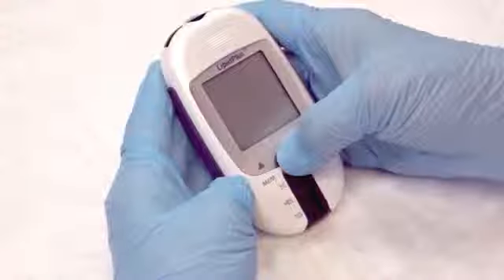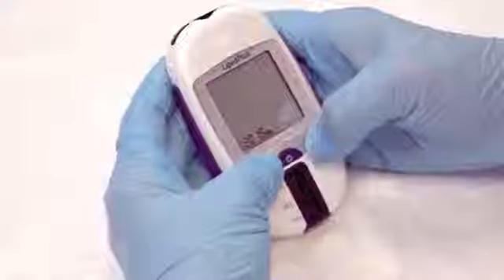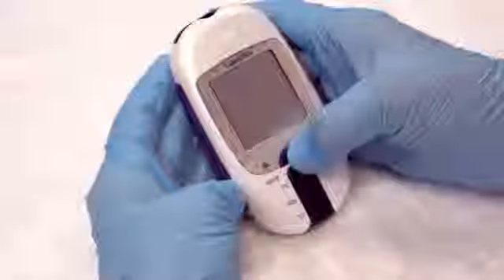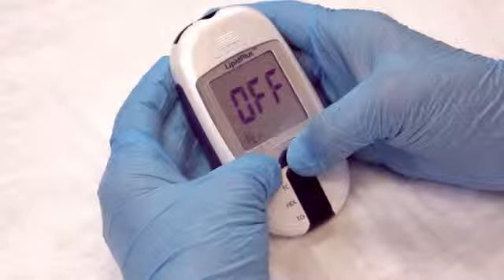To initially set up the analyzer, press the mode button for 3 seconds. Date and time and other settings can be modified by pressing the mode button and selecting the up or down buttons. If you are using a printer, be sure that the printer PTR on setting is selected. If printed results are not desired, select printer PTR off.